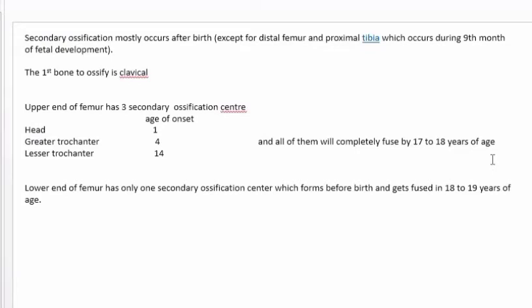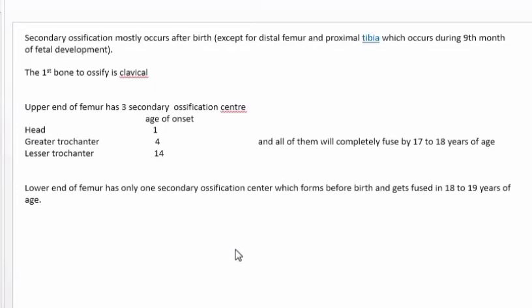To recap: the three upper femur ossification centers - head, greater trochanter, lesser trochanter - appear at one, four, and 14 years of age respectively (one, four, fourteen). The lower end forms before birth and fuses at 18 to 19 years, while the upper end all fuses at 17 to 18 years of age. Keep these points in mind as we look at X-rays and apply this knowledge to estimate the age of the individual.